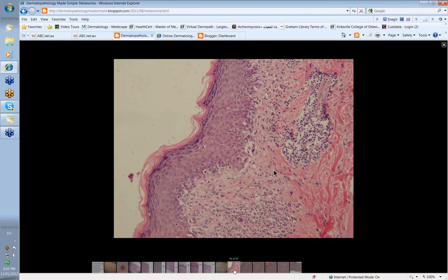What it would have shown in those pink areas is probably mainly vascular changes. You would have seen dot vessels, and you may have seen polymorphic vessels. There would have been a mixture of vessel types in that area. But it can be very difficult to diagnose that type of lesion, even with a dermatoscope. But if we look at the histopathology, this is what we had with this particular patient here.